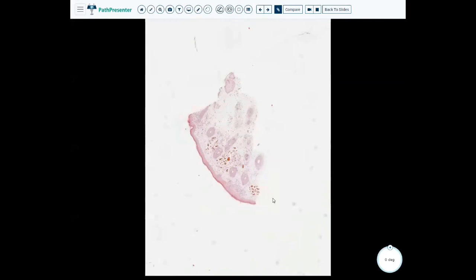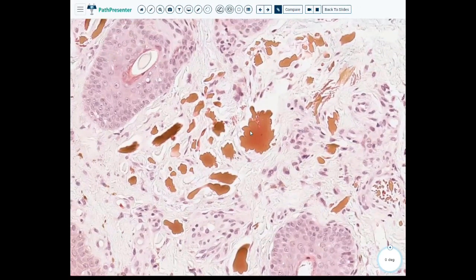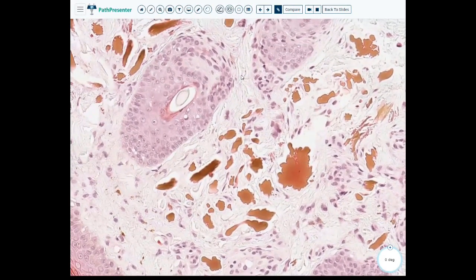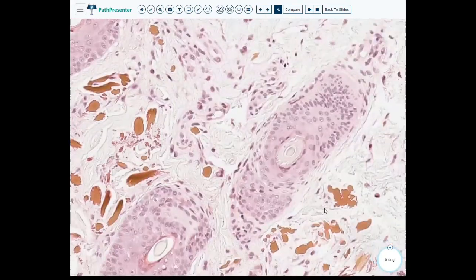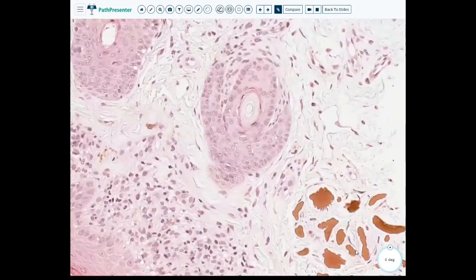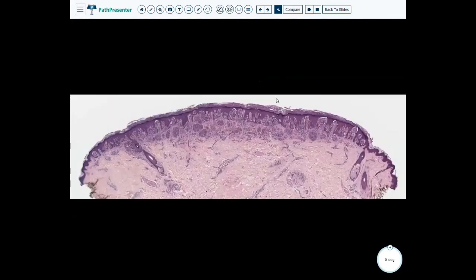Case 10, so again, we see the pigmentation, and hopefully even at this power, you're thinking, this looks like ochronosis, and guess what? It is ochronosis. I just thought this was really lovely because the shapes really weren't necessarily banana shaped in this one, and you can see more of the glassy appearance of the pigmentation. So I just thought this was a really nice case for that. And what you're seeing in some of the pigments is that this looks like red cells trapped within the pigment. Okay, so ochronosis.